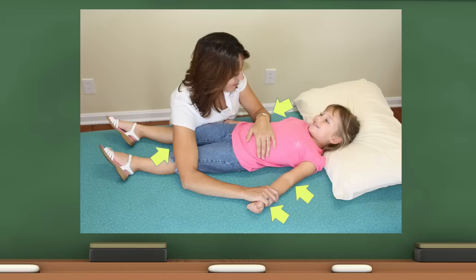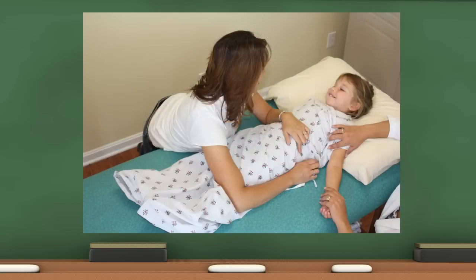You might want to see if the parent can accomplish that as well. Otherwise, you might need another assistant. The venipuncture can then be performed. Alternatively, you can wrap the child in a hospital gown to restrain the arms and legs. Then the parent is more likely to apply control where needed should the child become anxious.